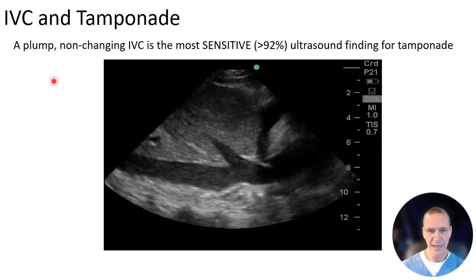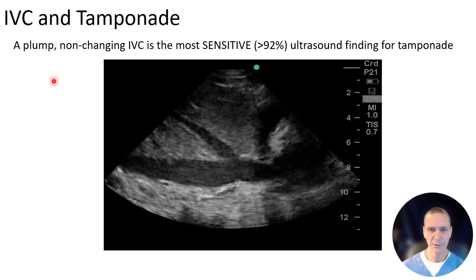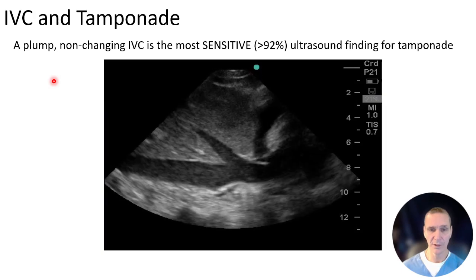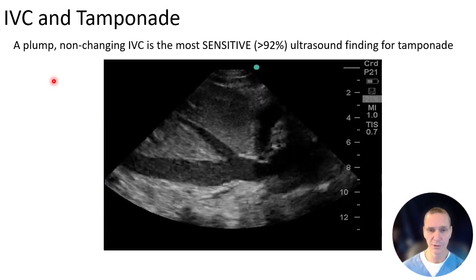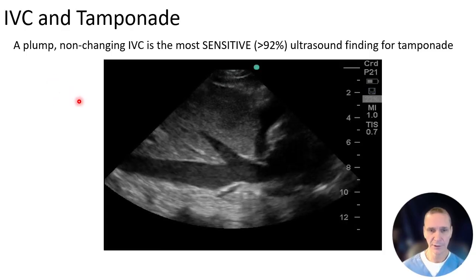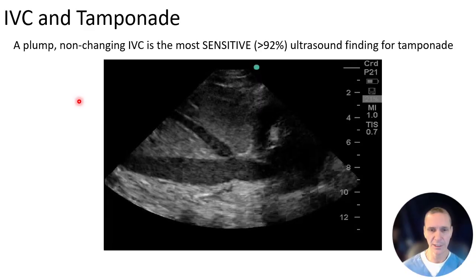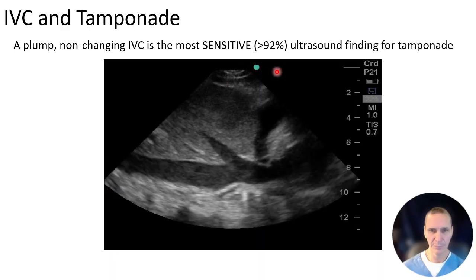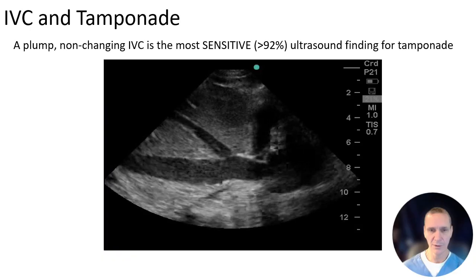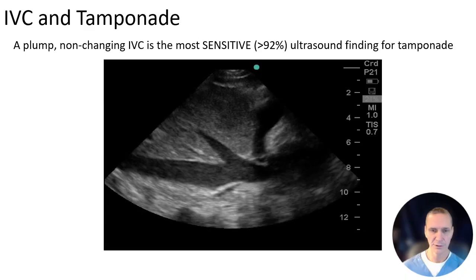While a large and dilated IVC may not tell you anything specifically, it can be used to help rule out cardiac tamponade. So if you have cardiac tamponade, you should have a large IVC that's dilated. So if you're thinking cardiac tamponade and there's no IVC dilatation and variation, while not perfect, it's unlikely that cardiac tamponade will also give you a small IVC with variation.